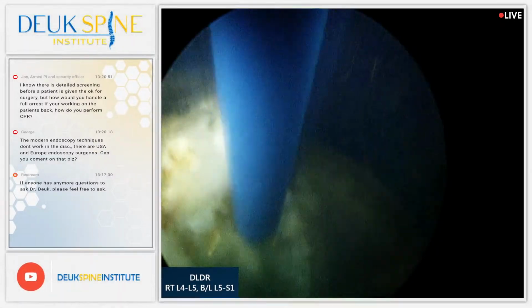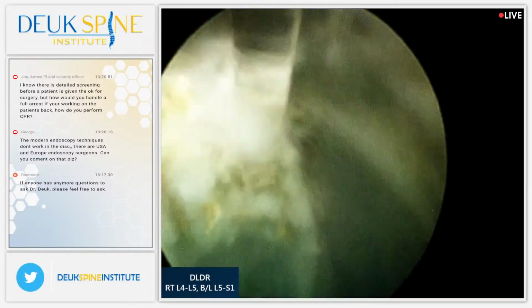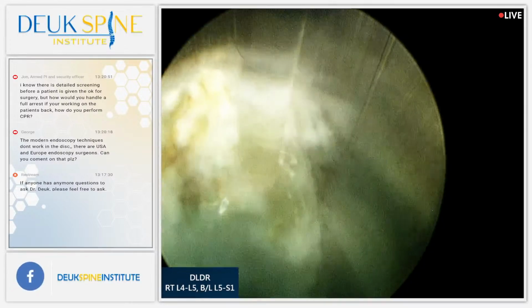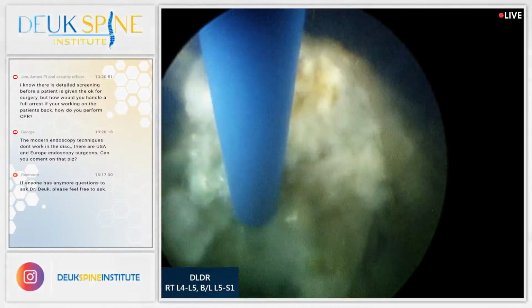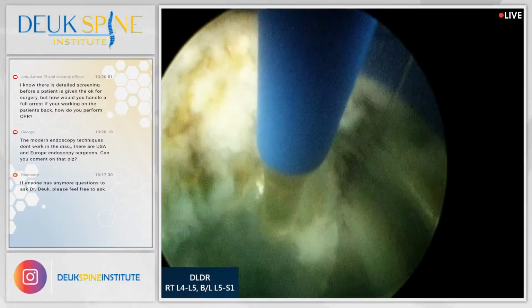Basically, we'd have to pull the tube out, which takes about a second. And then we'd have to staple the wound, which takes about 2 seconds, so that's 3 seconds. By that time, we'd have the gurney in, the fluoro out, and we would flip this patient on their back so we could code them. We already have IV access.